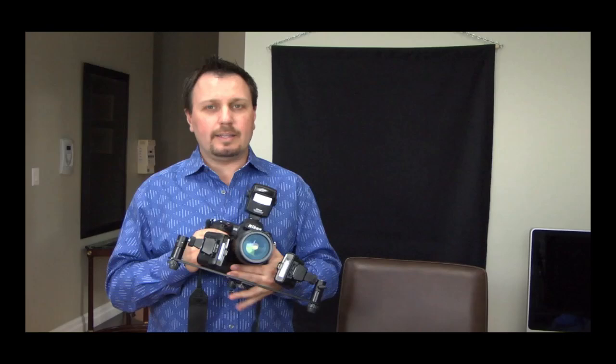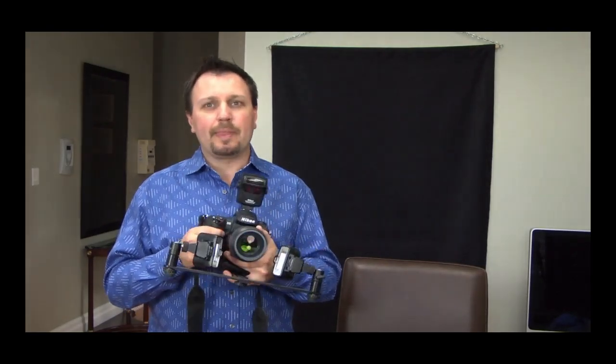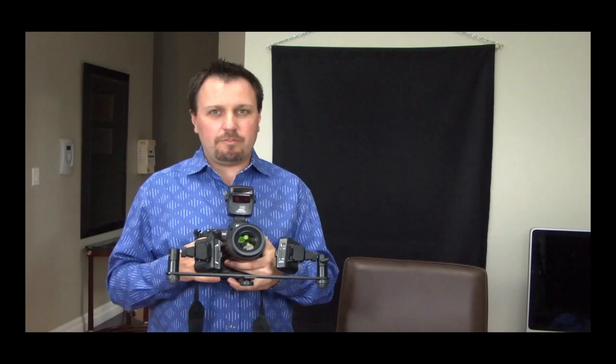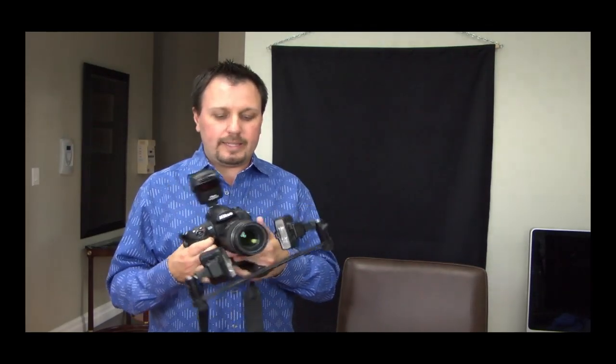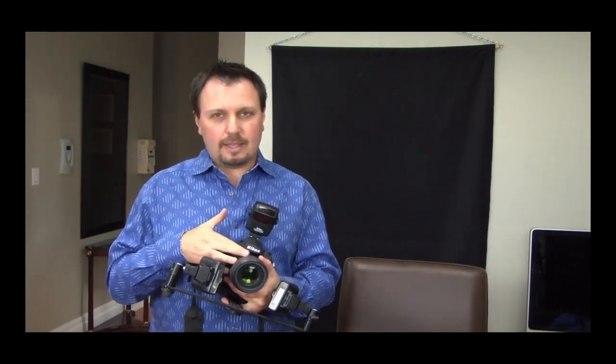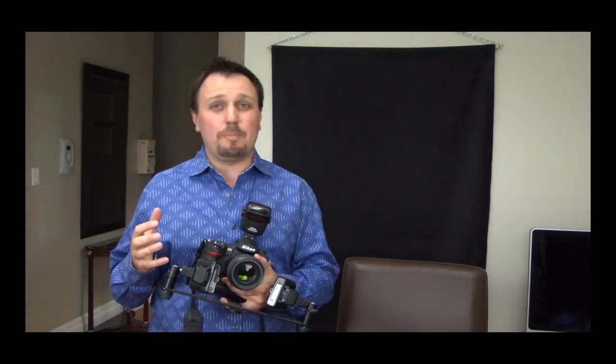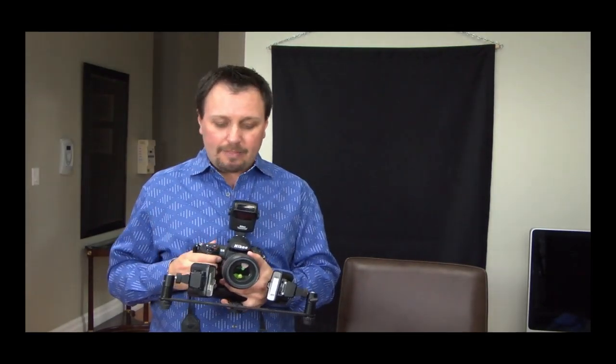I'm going to show you the setup that I use for my dental photography. Basically I have my main camera right here and it's a Nikon D3. I'm using a D3 body with the vibration reduction 105 micro Nikkor lens, and this is an excellent lens for dental photography — really good glass — and vibration reduction is excellent for macro images as well.